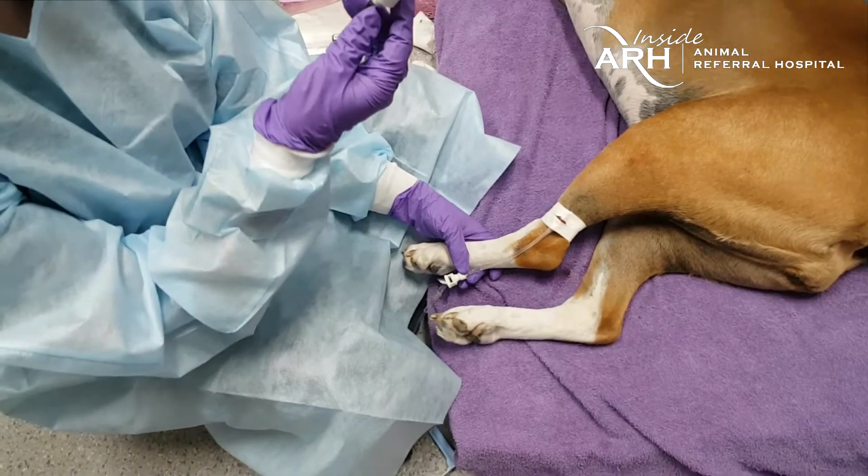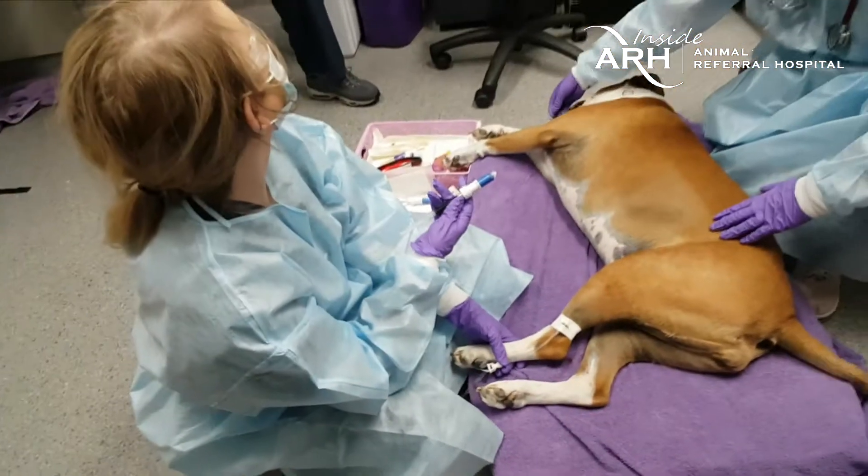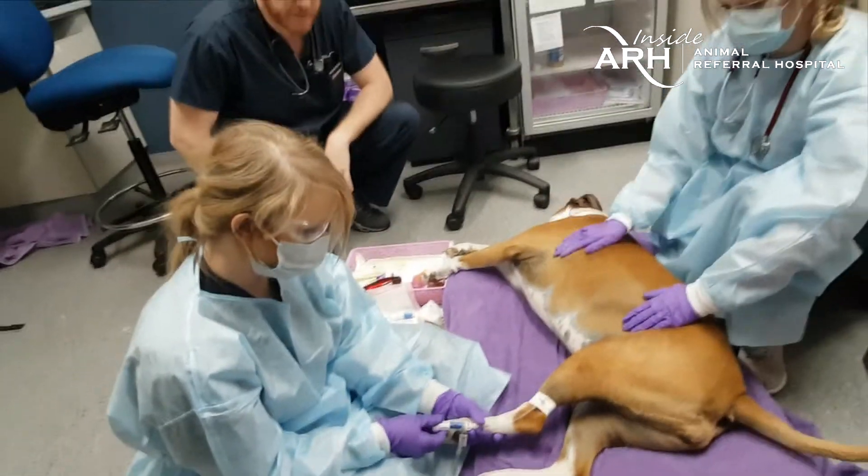Two and a half mils of the chemotherapy agent is prepared. The nurse confirms with the veterinarian before proceeding, and administration begins.